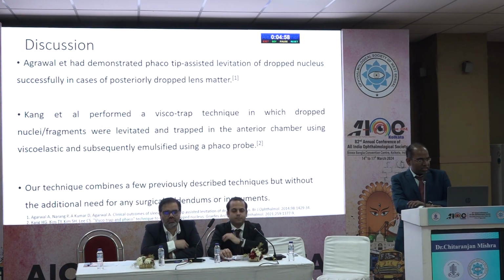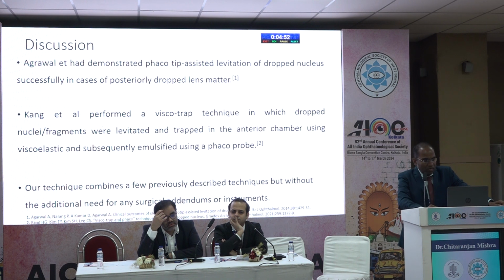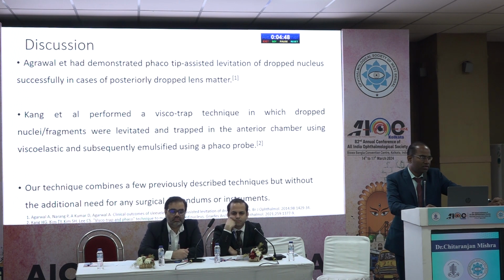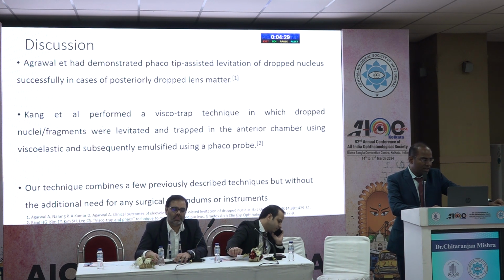So just to discuss, I am not telling it's a path-breaking innovation or something. Agrawal et al. have demonstrated a phaco tip assisted levitation of dropped nucleus in these kinds of situations. Kang et al. have performed a visco trap technique. So our technique is basically a combination and some addition of existing things, what we can call a jugaad, but may not be fitting as an innovation.